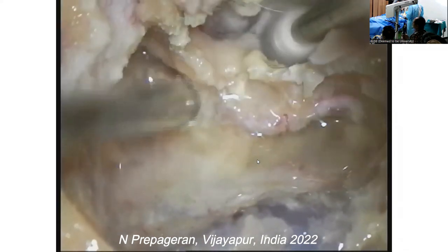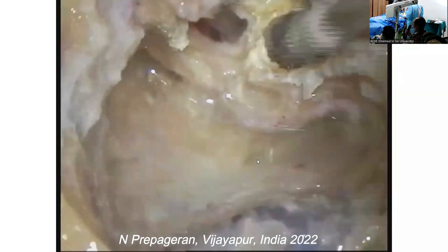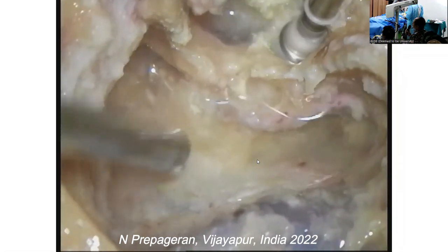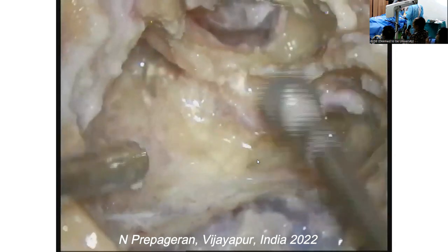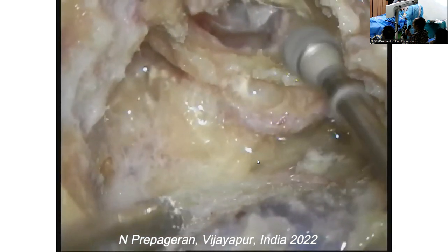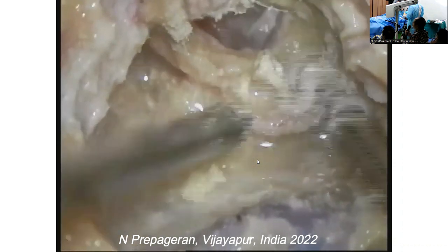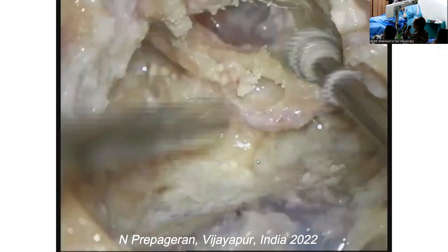Can you see the blue coming into view? Yeah, that's the jugular bulb. There. So I'm going to remove all this bone. All this is the external tympanic plate, you know? Okay.